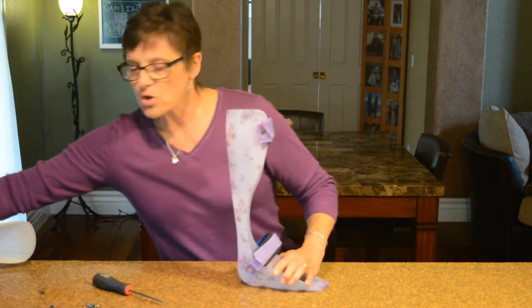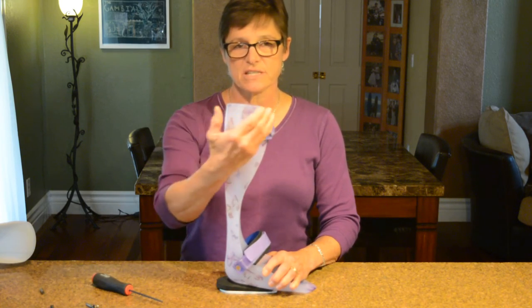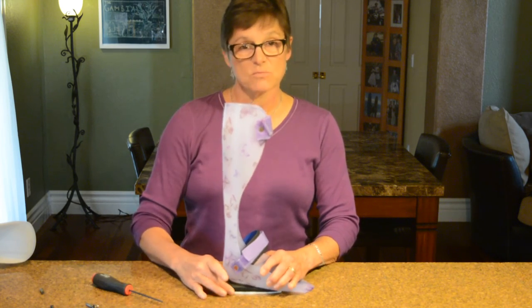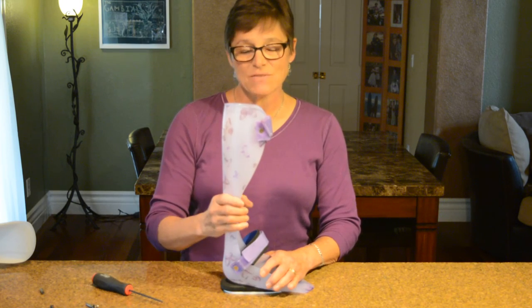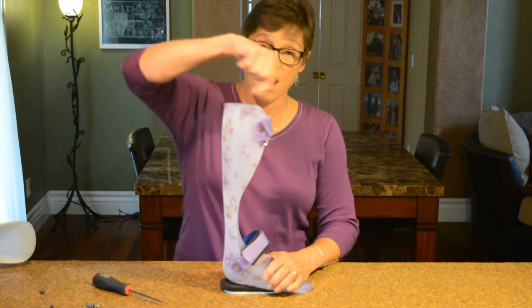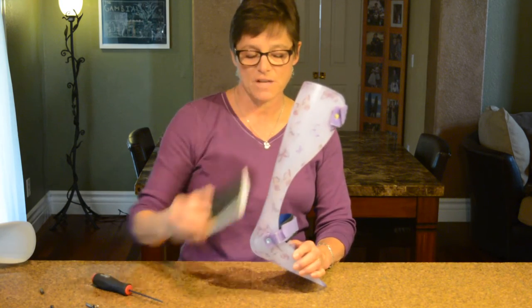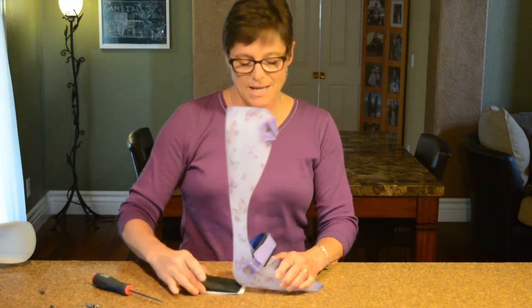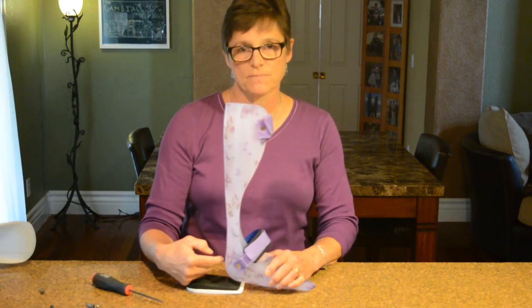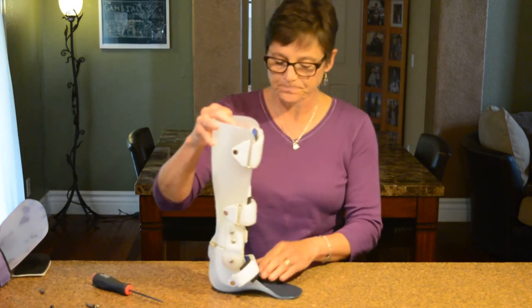If your patient is continuing to hyperextend — you're seeing an extension thrust — and you want to create a dorsiflexed tibia but this rigid AFO has no joints to adjust, what can you do? Add heel lifts underneath the brace inside the shoe. Watch what it does: it tips the tibia forward and creates some dorsiflexion. So even though this brace was set in too much plantar flexion, you can create an effective plantar flexion stop by adding something as simple as a heel lift under the shoe, under the brace.